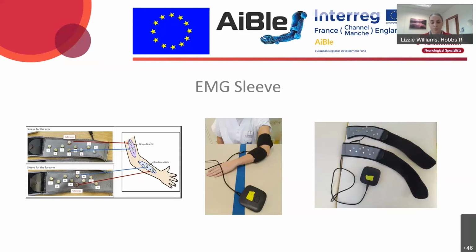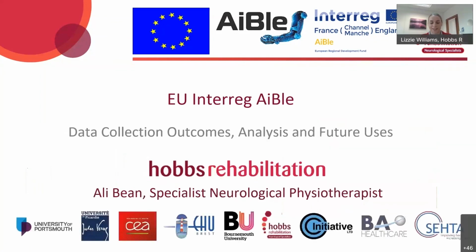However, the team from Portsmouth University opted to swap this to a wireless alternative to aid with therapist handling, as well as the quality of the data received from the sleeve. Please see on screen the photos of the wireless EMG sleeve. I'm now going to hand over to my colleague Ali to take you through the functional movement data collection and analysis in more detail. Thank you.